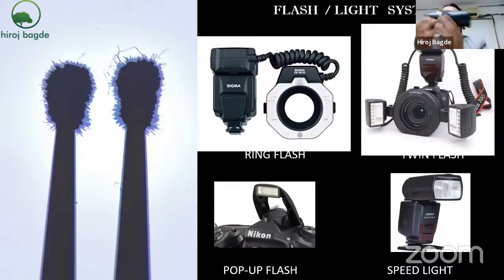Lights are important because I need to standardize the light which is going to enter my lens and whichever is needed for me. So I have explained the exposure cycle. In that cycle, I have told about the F number which is in the lens. Then I have told about the shutter speed and the ISO or the light sensitivity. In that, these two things are being controlled by the amount of light which we are going to give.